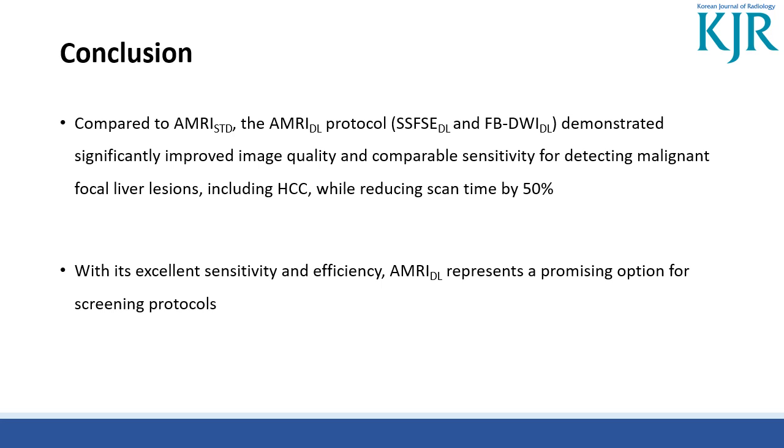In conclusion, compared to standard AMRI, the deep learning AMRI protocol demonstrated significantly improved image quality and comparable sensitivity for detecting malignant focal liver lesions, including HCC, while reducing scan time by 50%. With its excellent sensitivity and efficiency, deep learning AMRI represents a promising option for screening protocols.